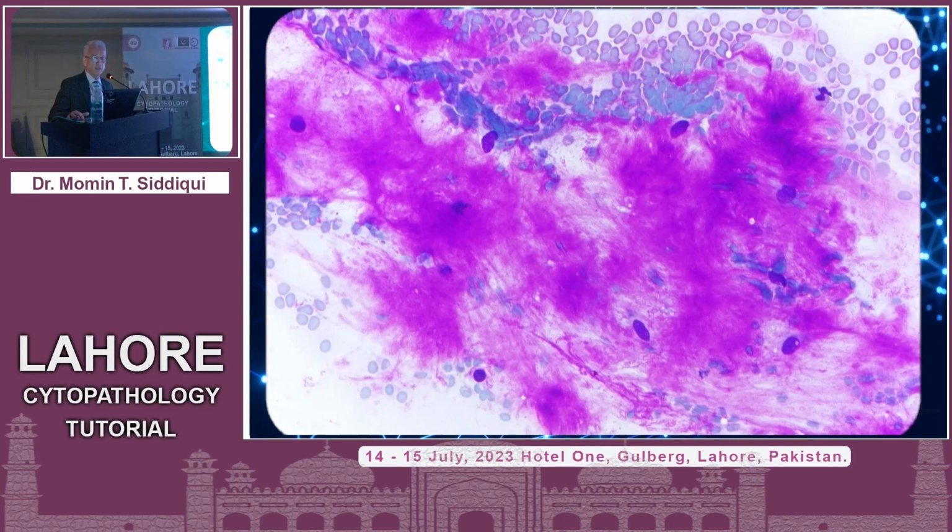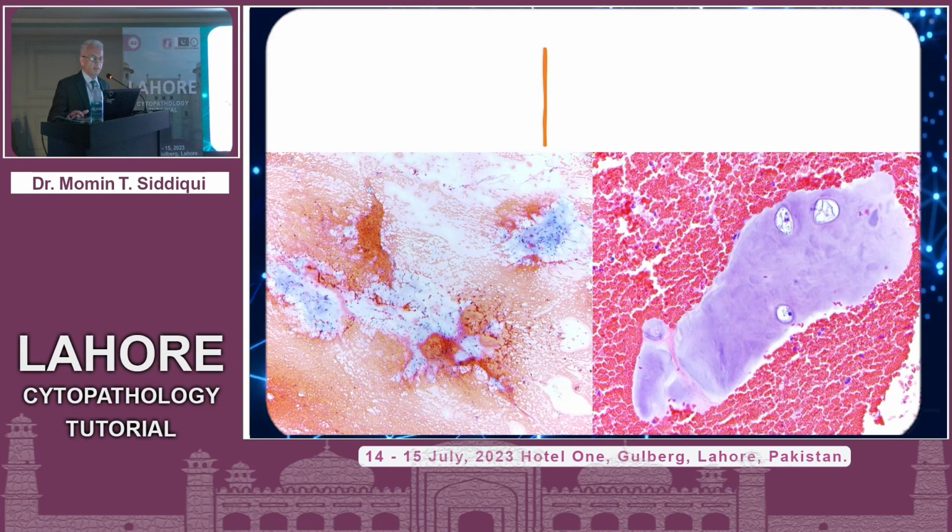So this is another case, very interesting, small lesion, peripherally located, really pink, magenta colored material. But main thing is the nuclei are there, but they are spaced apart. They are not really closely approximated. The nuclei are not showing any binucleation, magenta color. You probably know what this is. And this is the cell block, giving you nice pieces of cartilage. This is the smear, the pap stained smear, giving you cartilaginous material, which you saw on DiffQuick.